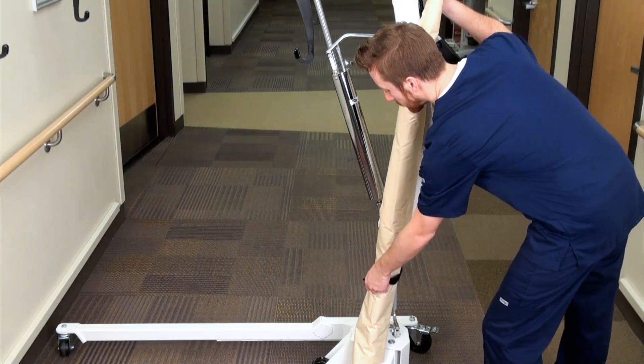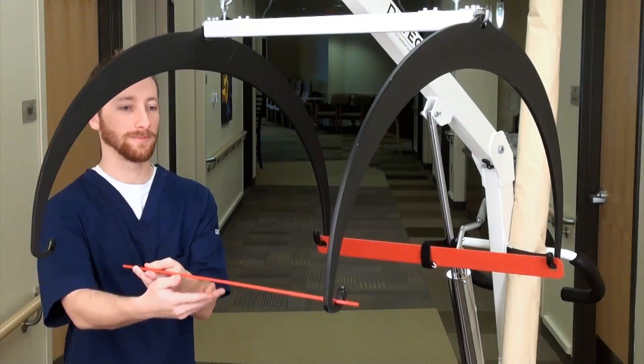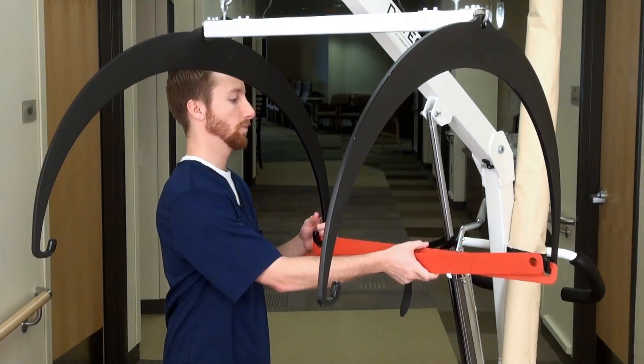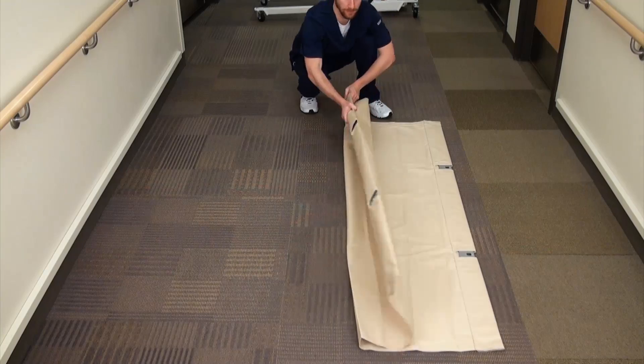Begin by undoing the Velcro straps holding the stretcher to the column. Next, remove the red transport bars from the support hoops. You can either set them aside or place them in the stretcher cup, attaching them to the column.